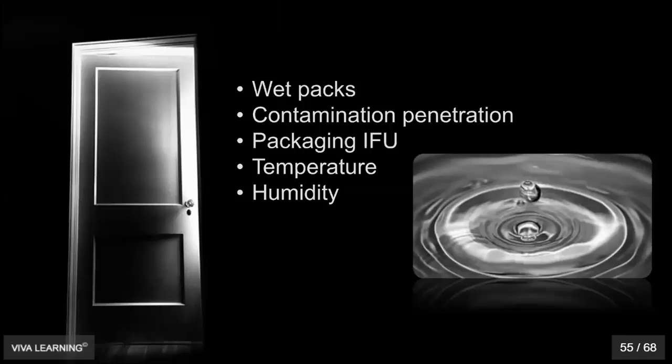One of the reasons is the countertop could be a cooler temperature than the instruments inside the pack. And when you put those metal instruments down on a cooler surface, you're just going to get more moisture than you had to begin with. You also can't do things like put them under a fan or under an air conditioning vent because you are having a risk of cross-contamination due to wicking, W-I-C-K-I-N-G. Until that paper is dry, that means the pores of the paper can still be open, and whatever types of organisms or fomites may be on a surface could in fact be transferred into that package that is still wet.